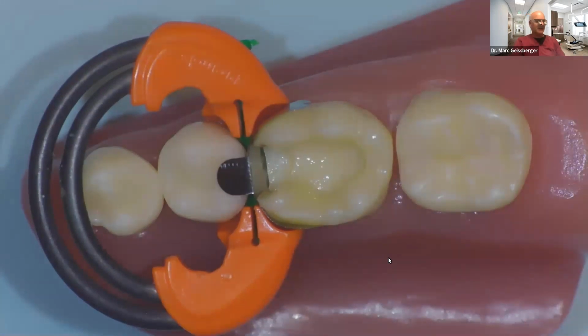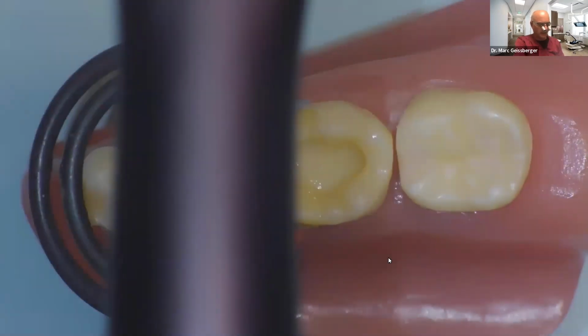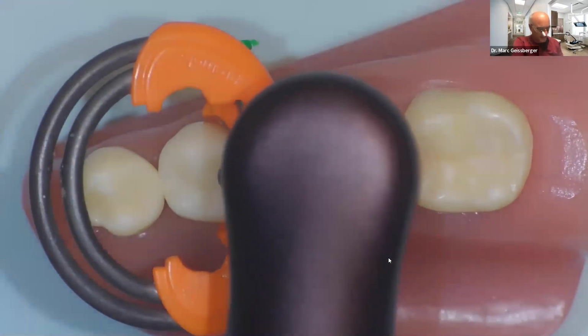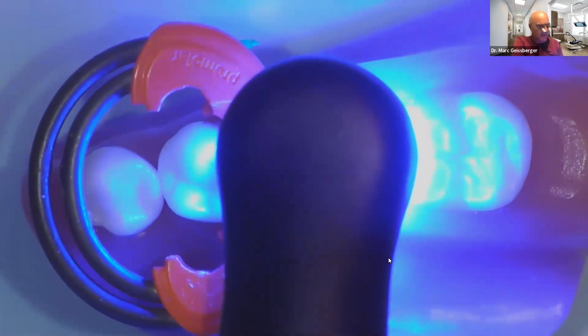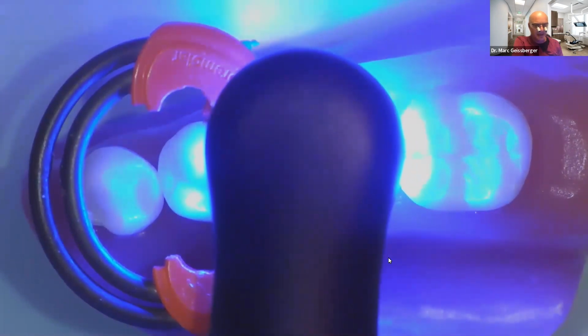Now, I've got this set for 20 seconds in the standard curing mode. I'm going to bring that right over my tooth and go ahead and cure for that 20 seconds. This light is going to beep at me every 5 seconds just to give me a heads up. And I'm going to go ahead and let that cure for a full 20 seconds. Why? I want my adhesive layer fully cured.